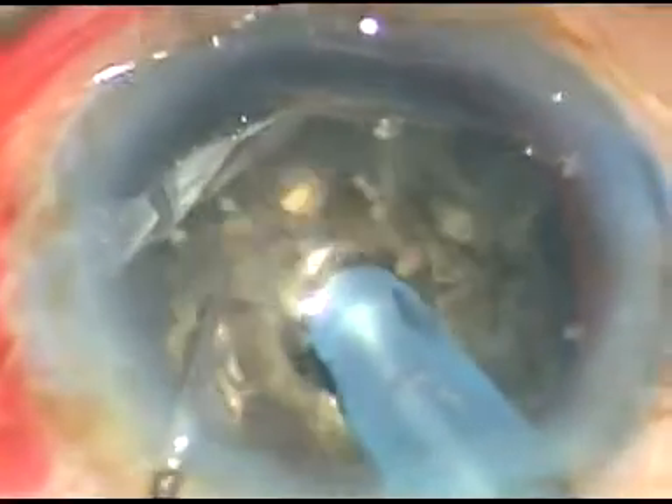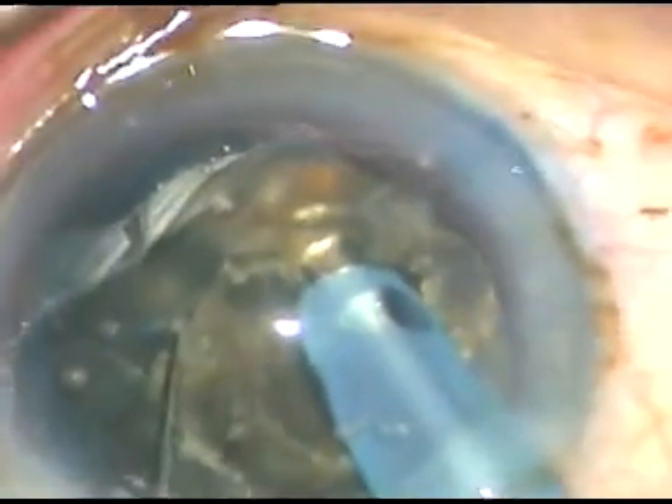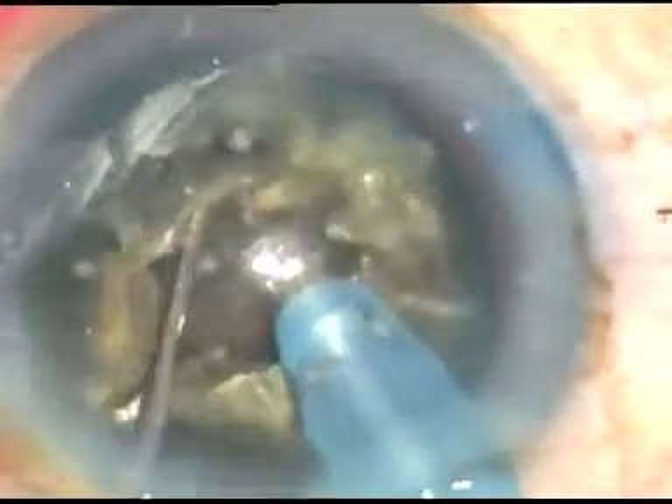Then I go to Phaco 2 mode. I don't do much lateral separation; I am taking adequate care of the zonules. What I am doing is rotating this mass 180 degrees. I can see the crack, and along that crack I am applying opposite forces. And see — this hard nucleus has been divided into two hemi-nuclei.